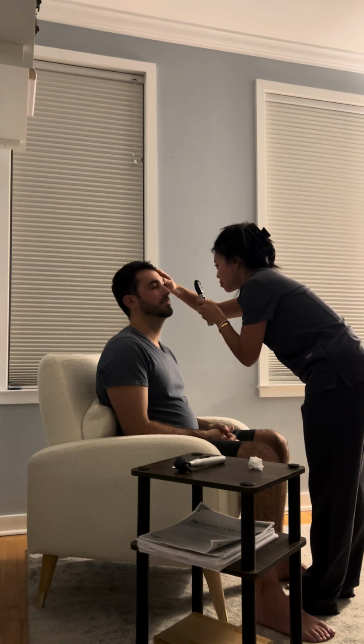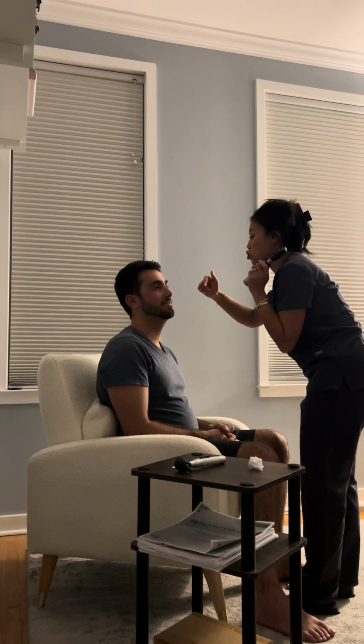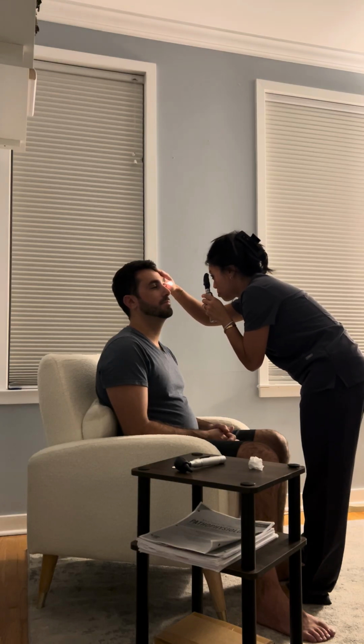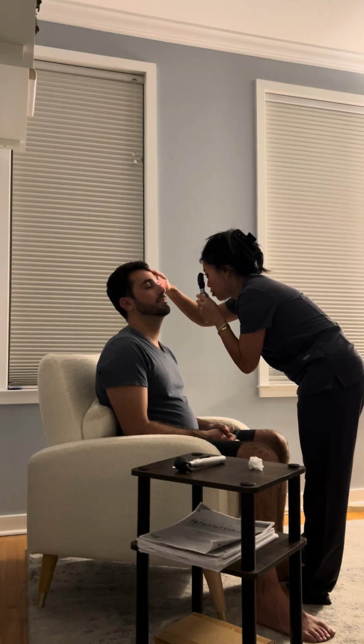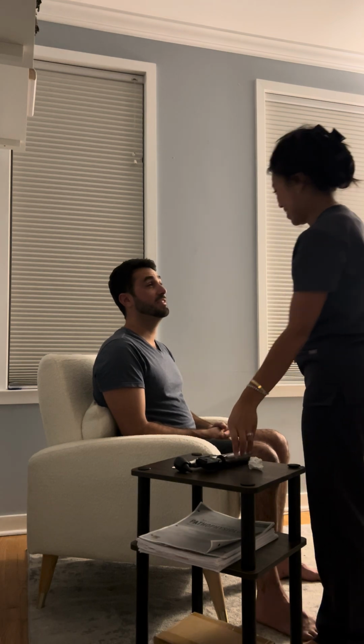Give you a moment. So keep looking just straight ahead. Over my shoulders. Same thing, going to look for the red light reflex. Good. Going to keep moving medial. Look for the disc and cup. And then I'm going to move lateral to look for the macula and the fovea. Okay, good. You okay? Yes, I'm okay.